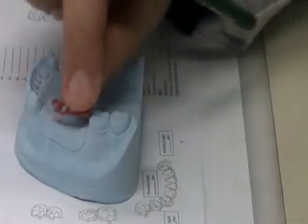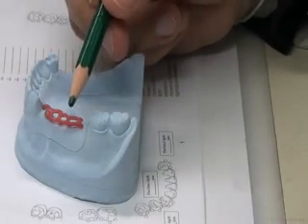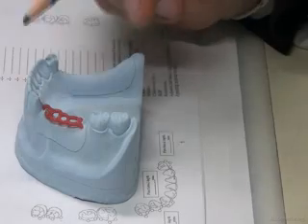The major indication to move to a mesh, for example, is occlusal clearance. An open lattice is thick. So if I'm going to place an open lattice here, I could do that. But the problem is it has some inherent thickness in it. Can I place a tooth over it and take good occlusion? This is my question.